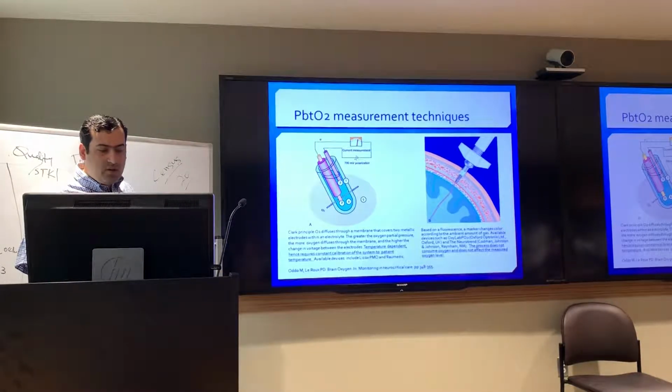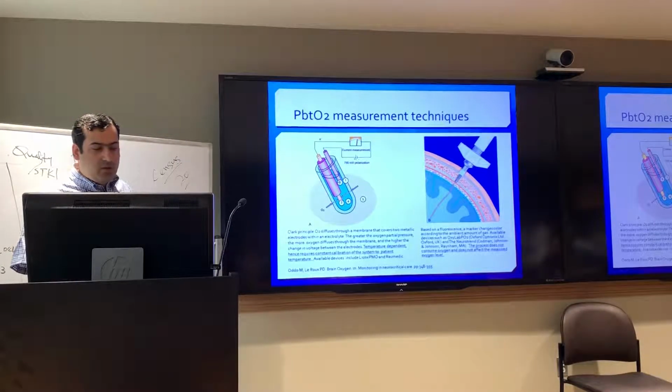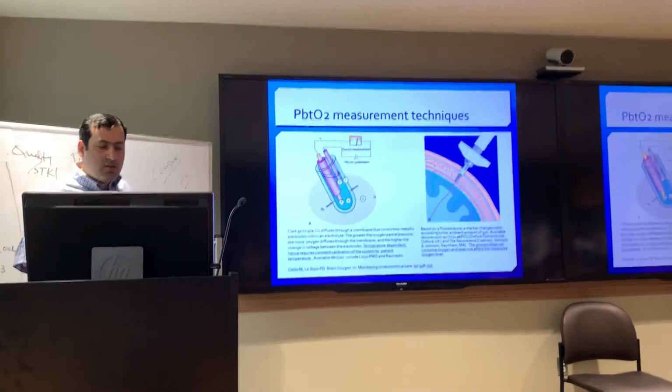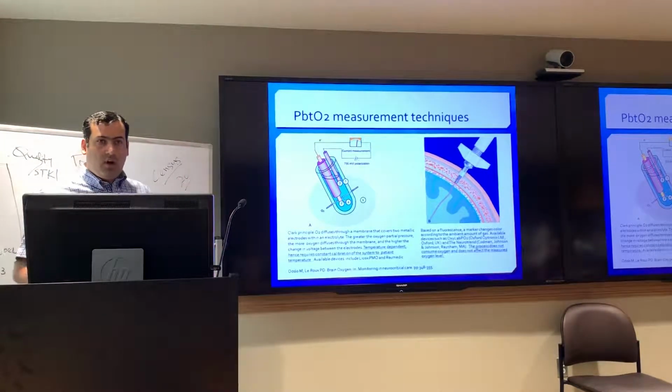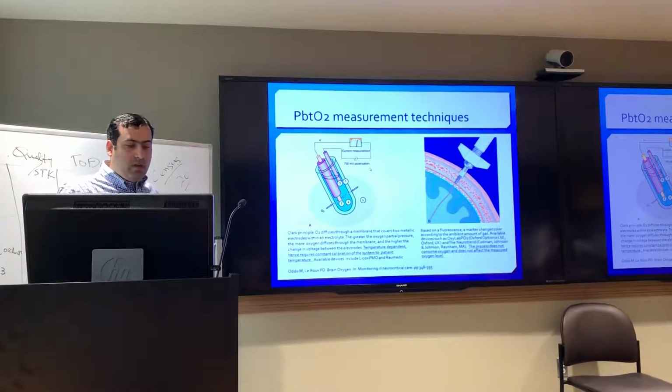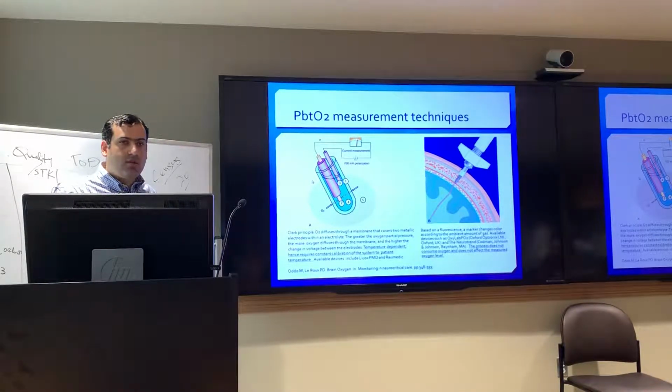Okay, how do we measure it? Two common methods are available. One of them is two electrodes in an electrolyte. If you have more oxygen, it diffuses more. It causes more voltage difference between the anode and cathode, and there's a higher current. So that's one way. That's what we use. Raumedic and Licox use the same technology. What's important here is temperature, because higher temperature means more diffusion. So these devices either need to be calibrated or self-calibrate by design, like Raumedic.